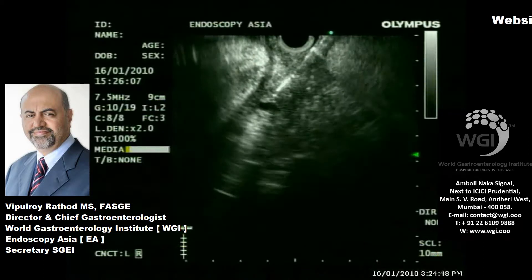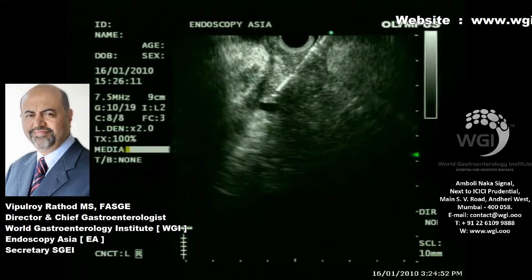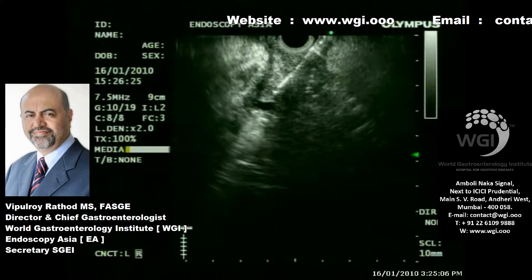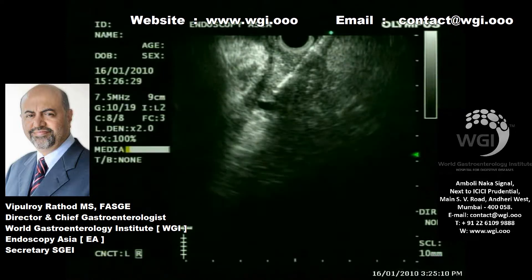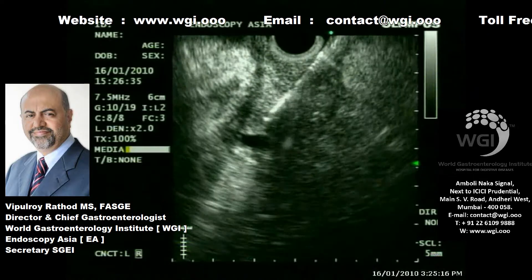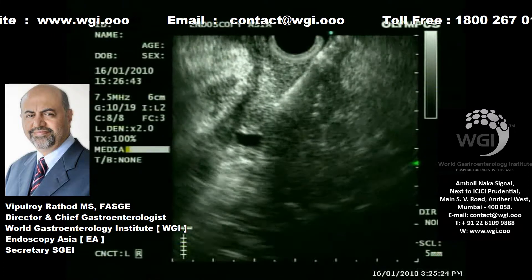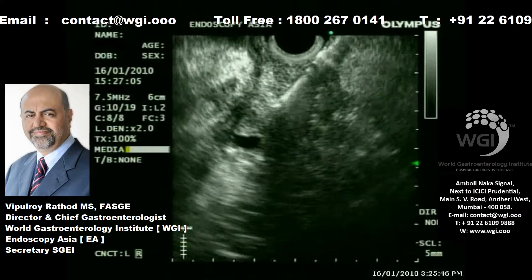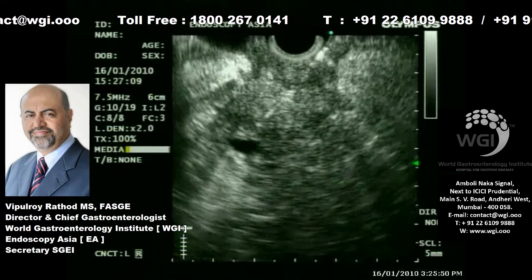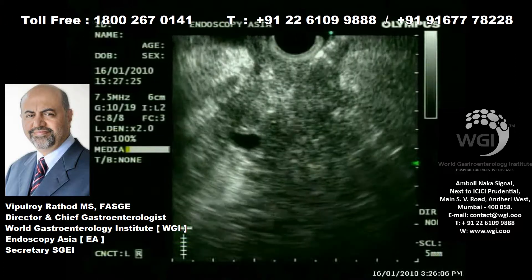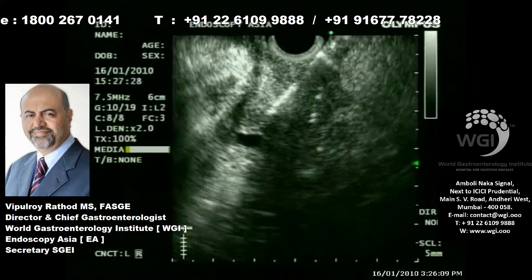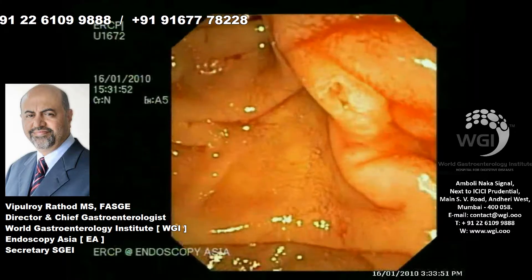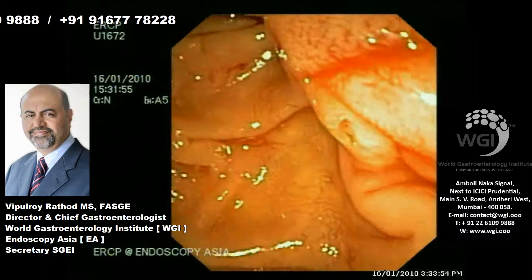You can see the tumor brought between the 5 and 7 o'clock position. We are using a gentle jab with a very small 25-gauge needle and will de-plug the needle with the stylet. It is our standard technique over 7,500 FNAs that there is no need to wriggle the needle aggressively in the lesion, as that can lead to a lot of blood. Very gentle to-and-fro maneuver of the needle within the tumor up to the periphery of the lesion — we stay there for about 30 to 45 seconds, and that is the end of the procedure. This is enough material aspirated from the lesion.